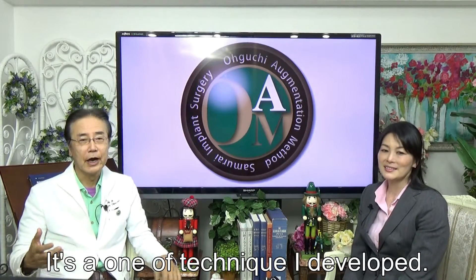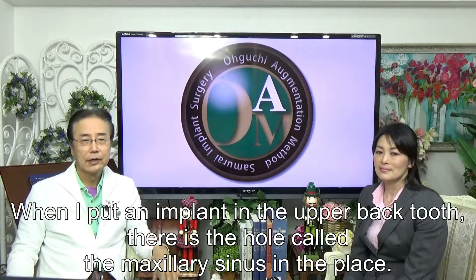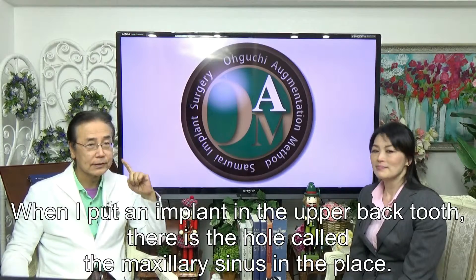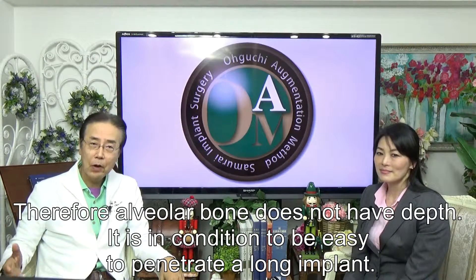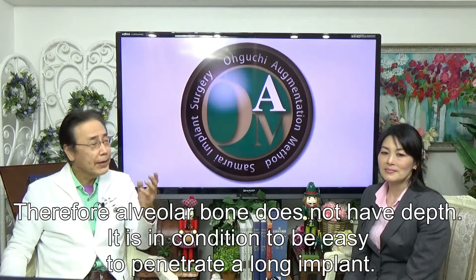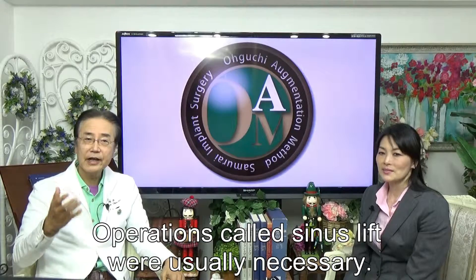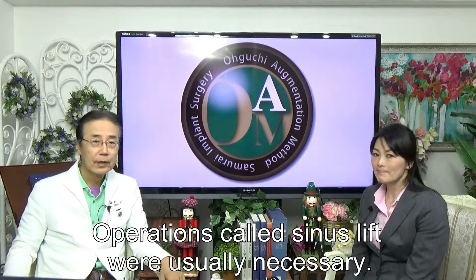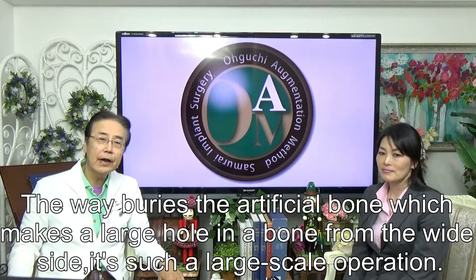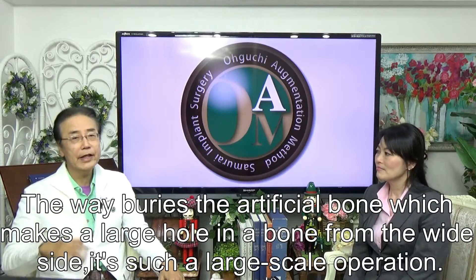It's a wonderful technique I developed. When placing an implant in the upper back tooth, there is a cavity called the maxillary sinus in that area. Therefore, the alveolar bone does not have sufficient depth, making it easy to incorrectly penetrate with an implant. Operations called the sinus lift were usually necessary — a large-scale operation where artificial bone is buried by making a large hole in the bone from the side.